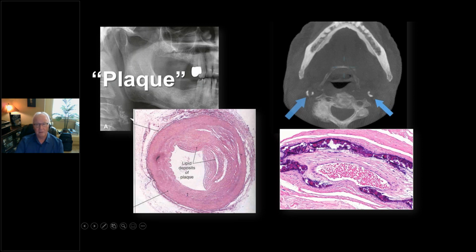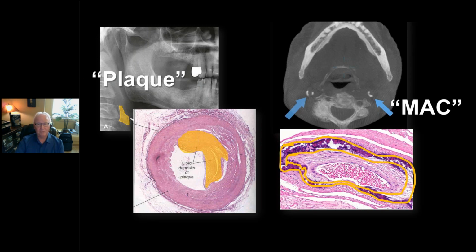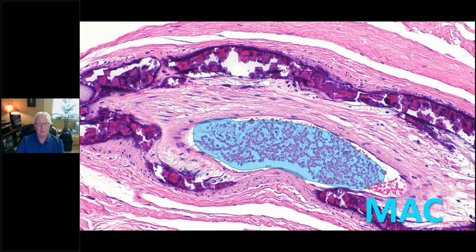So lumen, epithelial layer, muscular layer. This thing can't expand and contract. And this is macroscopic level. Guys, this has been happening at the microscopic level probably for years. This is why their kidneys are not working as well. This is why they get burning fingers and toes. This is why they get retinopathy, because by the time we see this, they're pretty far along. If you see this, I'd put the brakes on your implant case, okay? So this is pre-surgical, pre-implant planning that you're looking at.